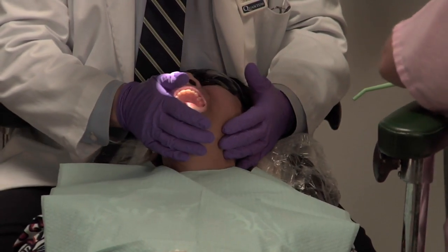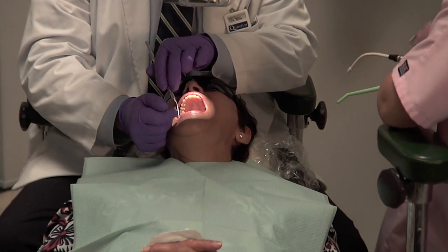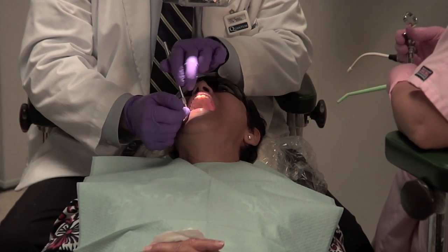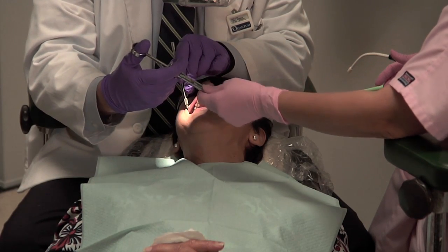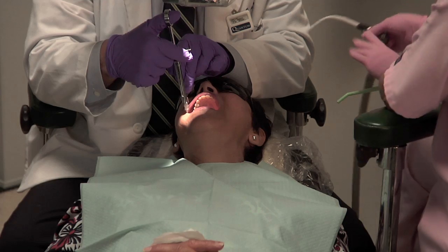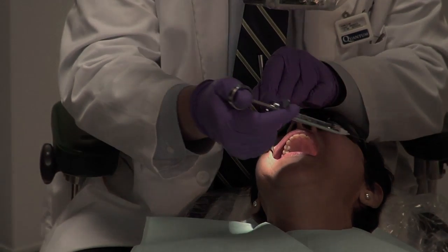Then I'll give a long buccal injection here as well — same type of procedure. You use the mirror, position the patient, and you have complete visibility for doing the long buccal. Arms on the armrests, completely at rest.